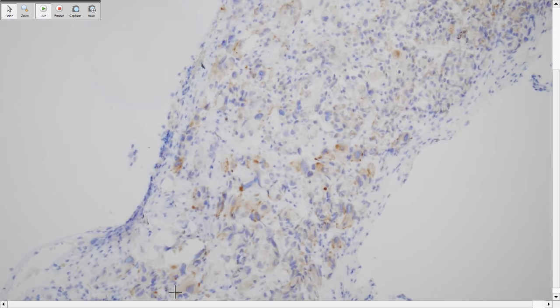Okay, next one. So yeah, this one is PSA. You can see NKX3.1. Sometimes NKX3.1 is better than PSA. Yeah. Okay, to this one.